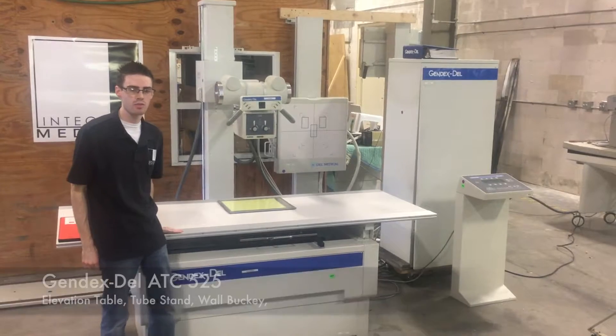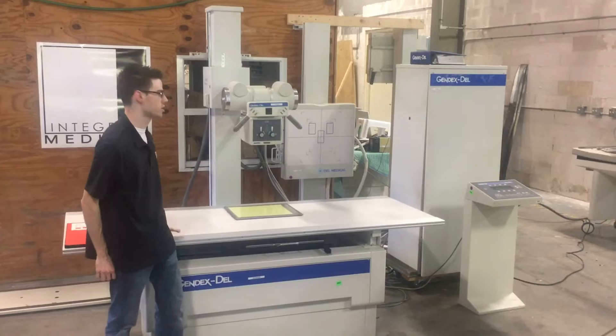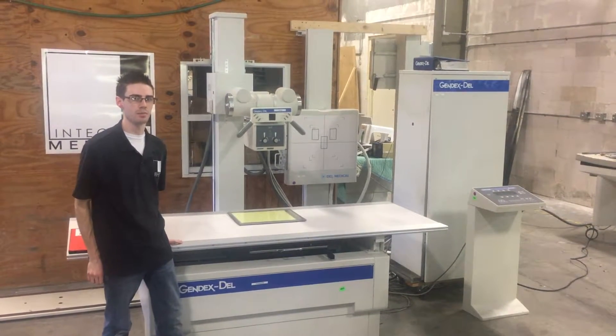Typically when we get one of these, we set them up and refurbish them for testing purposes only. What you see here is not how it will be set up in your medical facility.